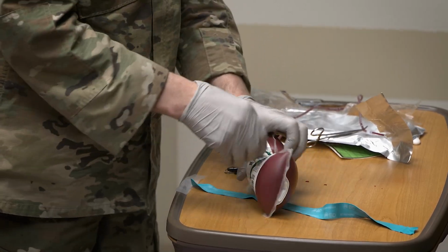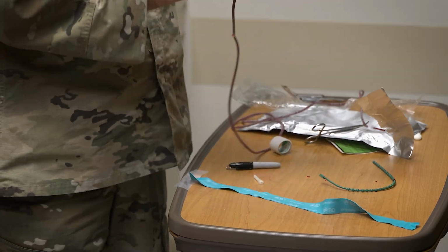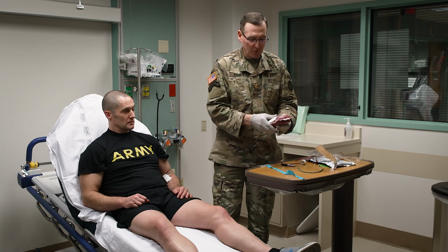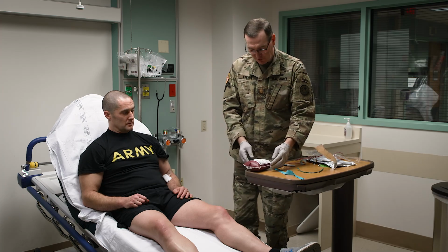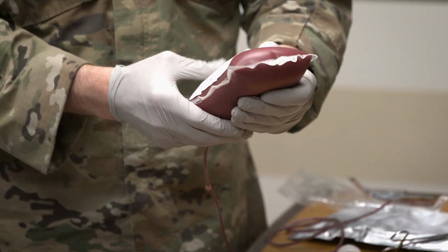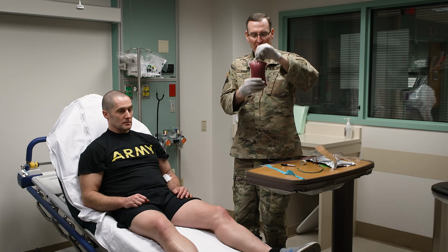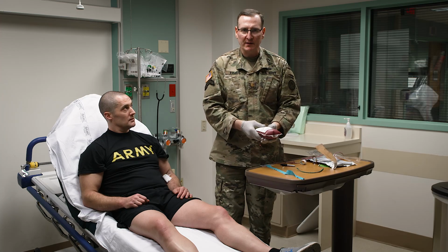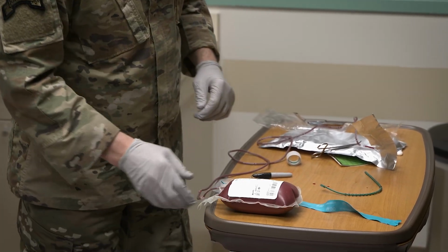All right. We'll take this off. We'll talk a little bit about these blood bags and, if you don't have a beaded cable tie, how you can tell if it's full. If you lay it flat, it should have some dimpling on the side. It should be firm but not taut. If you hold it up in the air, you should still see an air-fluid line in there. And overall, if you do it several times, you get used to that weight, how it feels. But that's probably the least reliable way to do that.